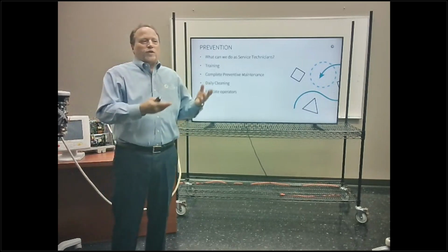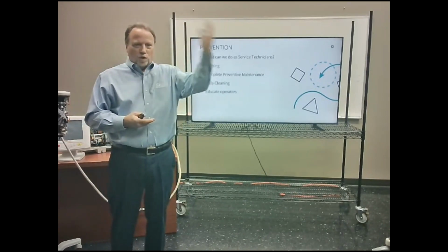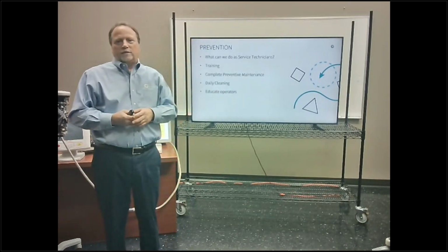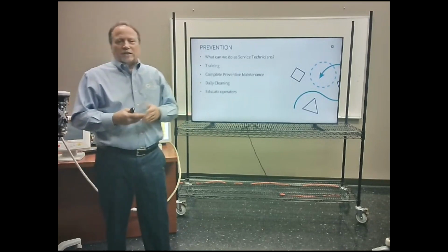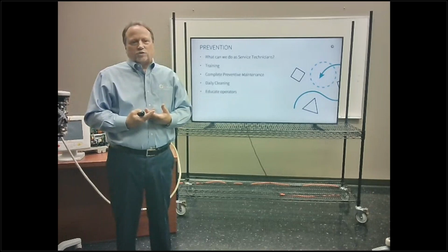Don't just go in and do, yeah, it's working. Okay, we've all been there, because your boss says, here's 400 that need to be done by the end of the day. That's not right. A good preventive maintenance is what these injectors need.